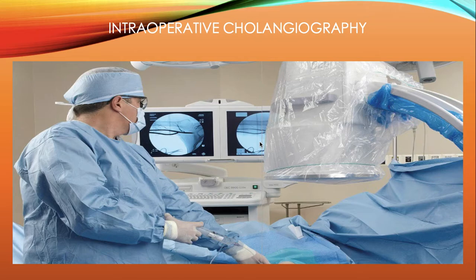So IOC, also known as intraoperative cholangiography, is most likely done after the removal of the gallbladder. The reason it's used is for the surgeon to see if there are any gallstones left, or if there's anything obstructing the bile ducts. Having an IOC has a success rate of 90%, and if there is a common bile duct stone still left, the IOC will detect it. The accuracy of an IOC finding a stone is usually between 92 to about 99%.